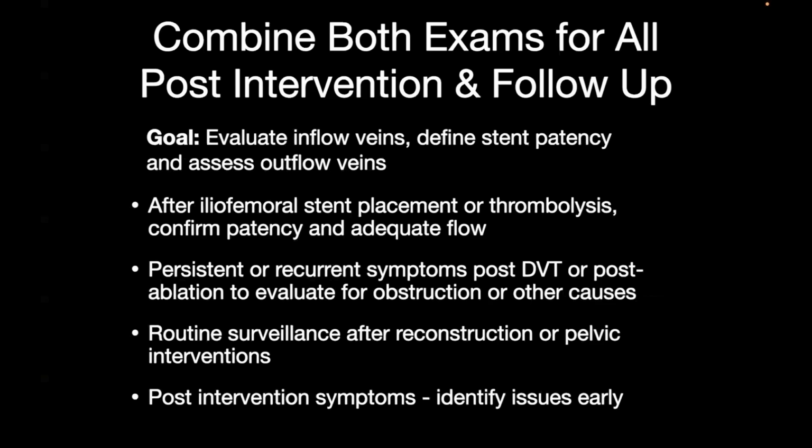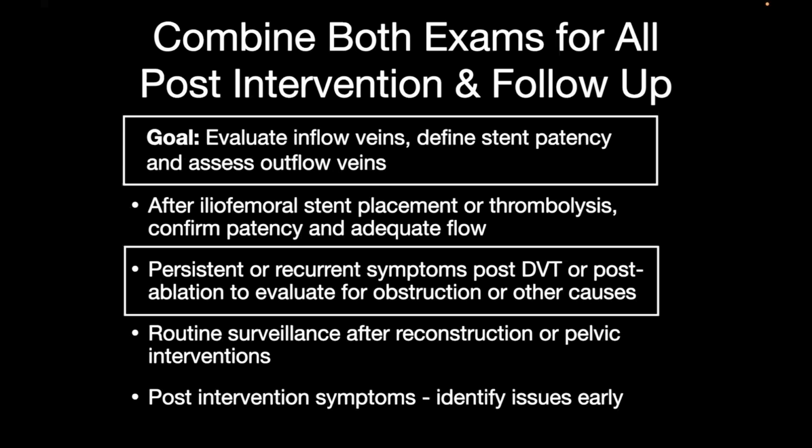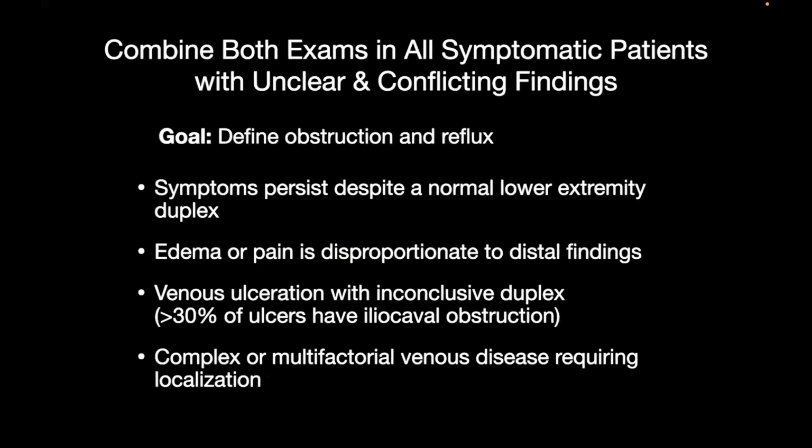Now, the goal here, again, straightforward. We want to evaluate the inflow of veins in these patients, define stent patency, and do a good assessment of the outflow veins as well. And certainly, if you have a patient that presents with persistent or recurrent symptoms post-intervention, again, you want to do your due diligence. You want to have that ability to scan both examinations and put it together and answer clinical questions. We certainly want to combine both exams in all symptomatic patients with unclear or conflicting findings.